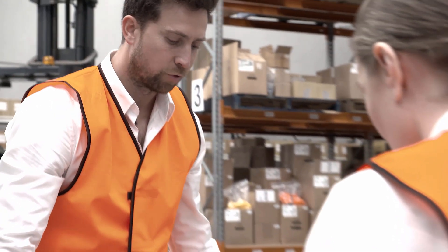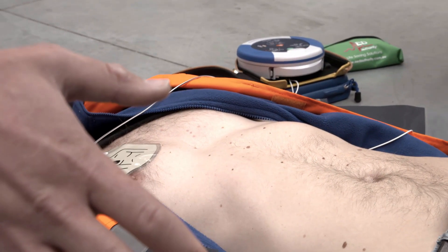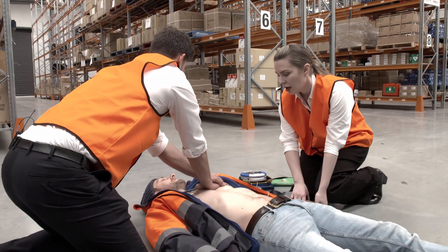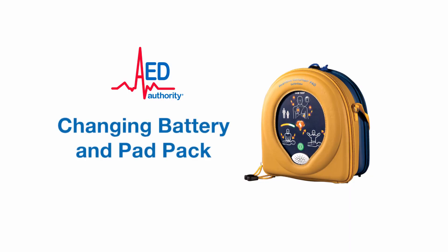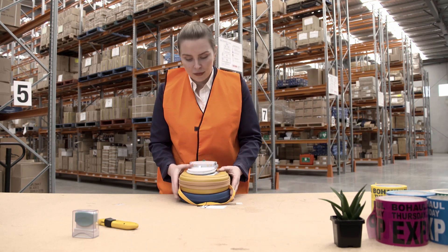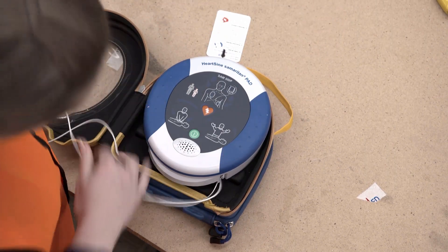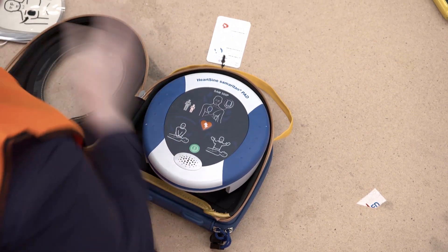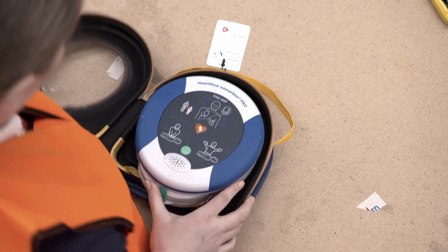Stop CPR — assessing heart rhythm, do not touch the patient. The 500P will then advise if another shock is required. Continue providing CPR until either the patient regains consciousness or emergency services arrive. After using the 500P, or after four years since purchase, you will need to replace the battery and pad pack. Press the two locking tabs on the side of the battery and pad pack and slide the pack out, then insert the new battery and pad pack until the tabs lock into place.